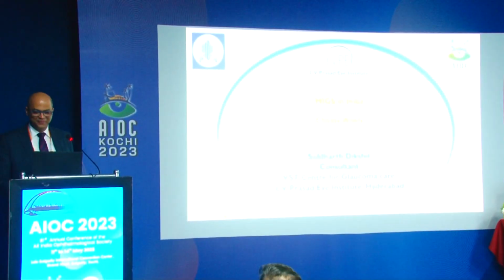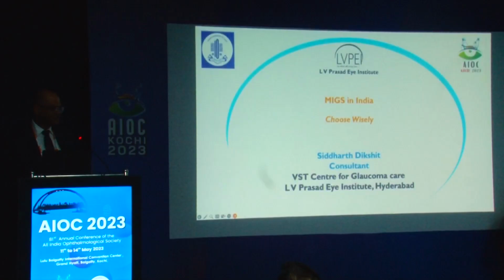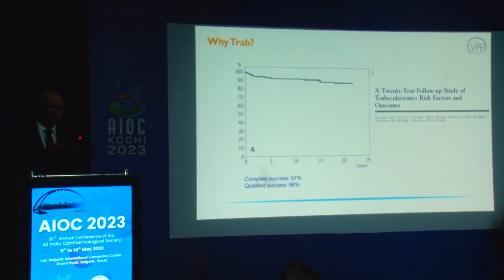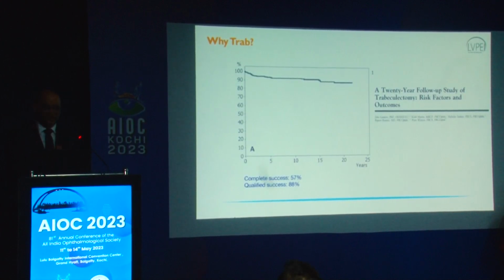So when we talk of MIGS, we should always give our pranams to the God. It is not intended to replace trabeculectomy. That we have to remember. Trabeculectomy is the most efficacious surgery for glaucoma, and when you want IOPs in the low teens or a patient has advanced glaucoma, this is where you go.